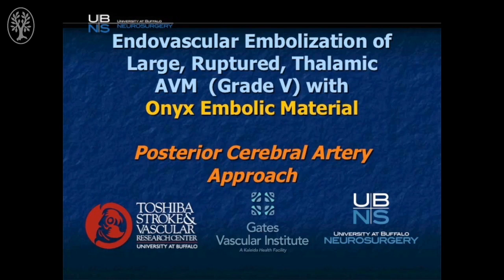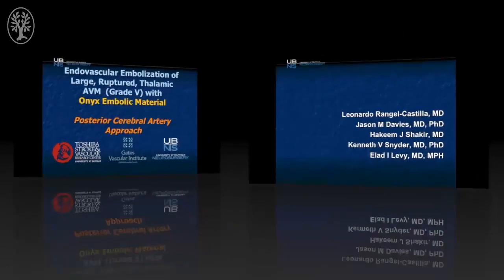In this next case, we will review endovascular embolization of a large ruptured thalamic AVM, grade 5, using Onyx embolic material.